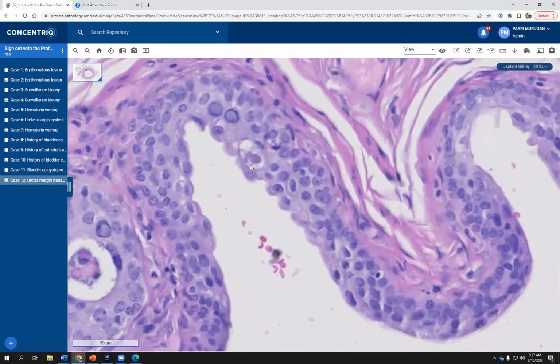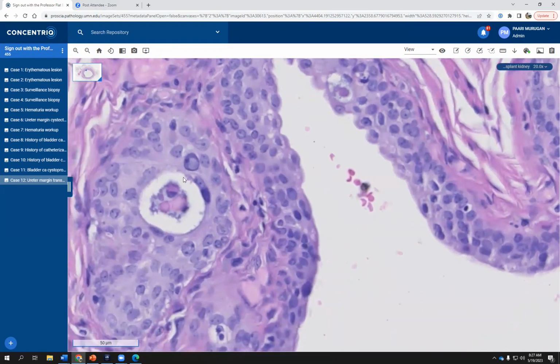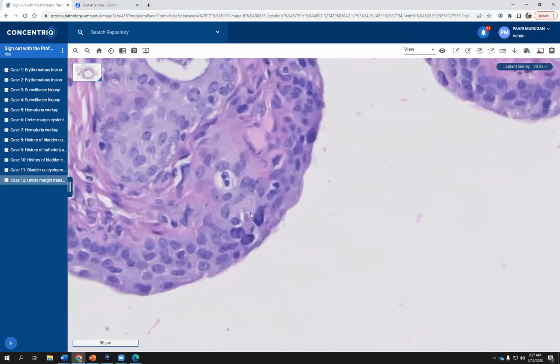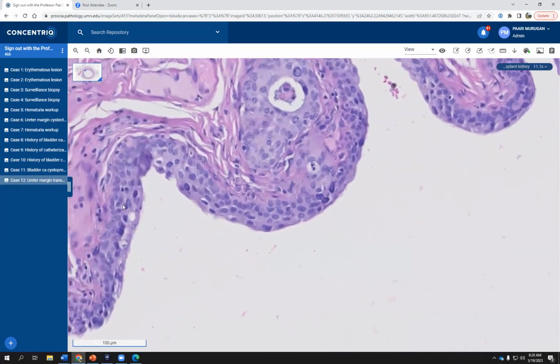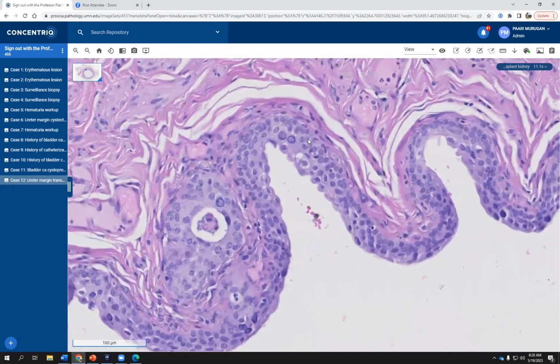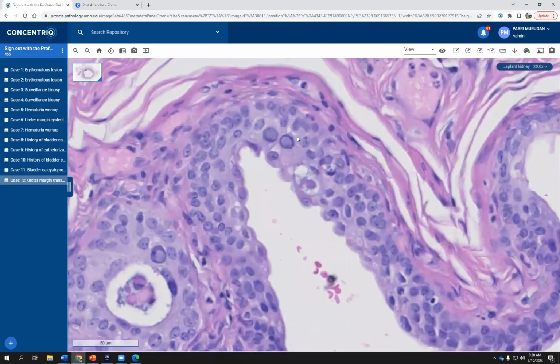The fact is that they seem to have some sort of a nuclear clearing in the center, and the chromatin seems to be pushed towards the periphery, forming a little rim. So there is homogenization of the chromatin in the center of the nucleus with the peripheral displacement of the chromatin, and in some areas you do have some hyperchromasia. So this is a phenomenon that might sometimes mimic carcinoma in situ, and it might do that even on cytologic specimens. But most of you know what this is, right? This is a BK virus cytopathy, or polyoma virus cytologic changes in the urothelium.